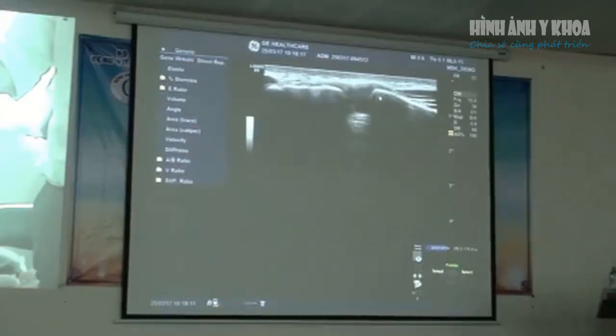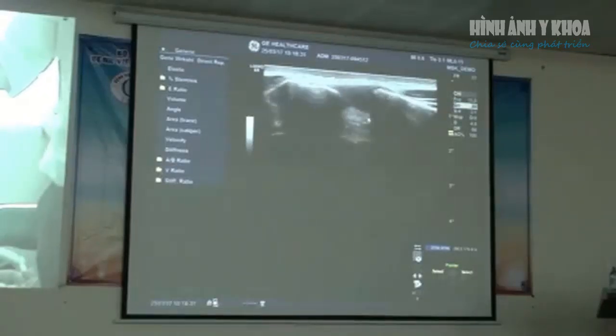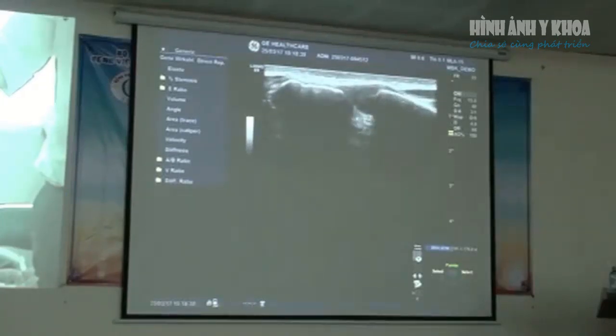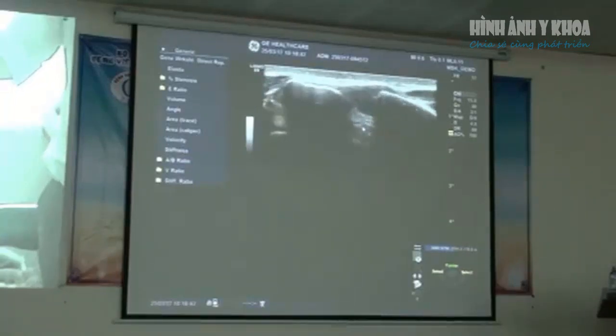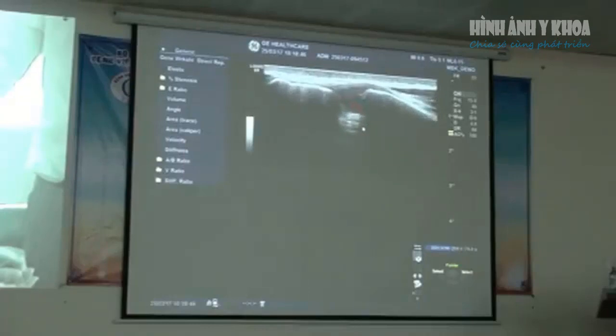So this is the distal clavicle. This is the AC joint: laterally is the acromion, medially is the distal end of the clavicle. And you can see here that this capsule is nice and smooth going over the top. And in this patient, you can actually see down into the subacromial space. So you can see that there's no real encroachment of that joint down into that tunnel.